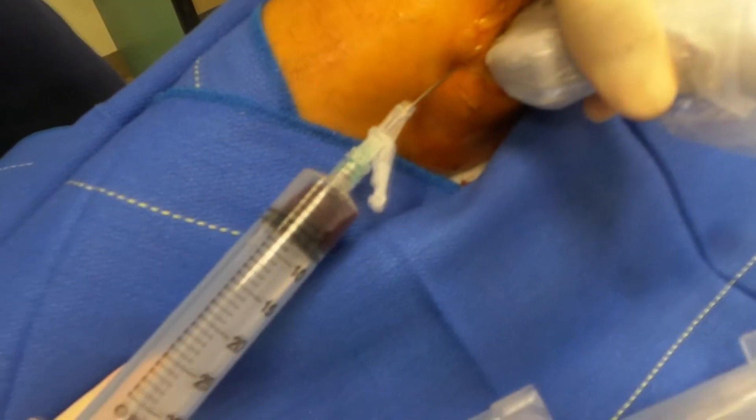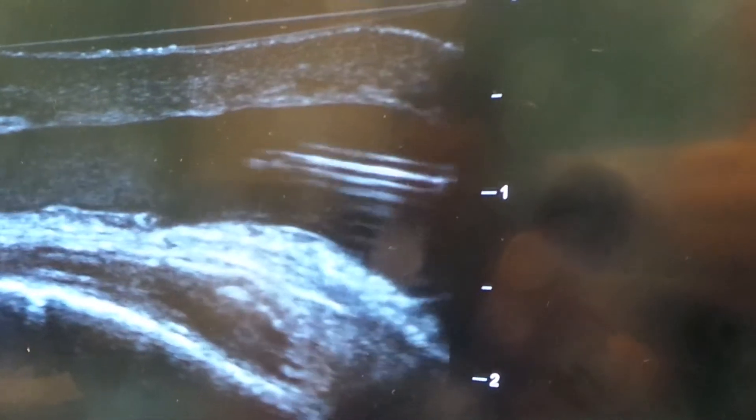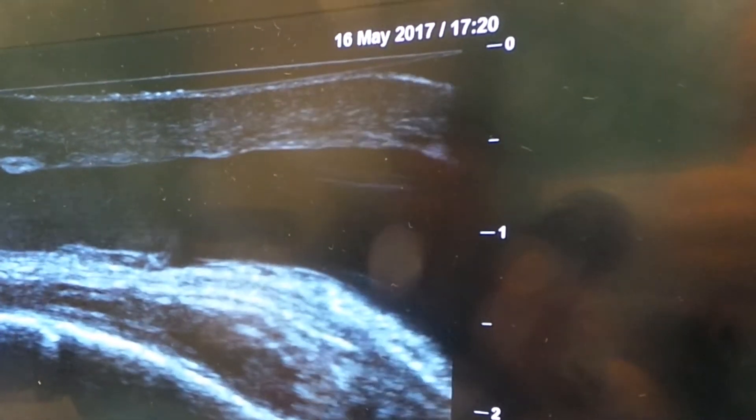It is hemorrhagic — I guessed correctly because I thought I was seeing some cellular content. The needle is still in place; beautiful view of the needle.